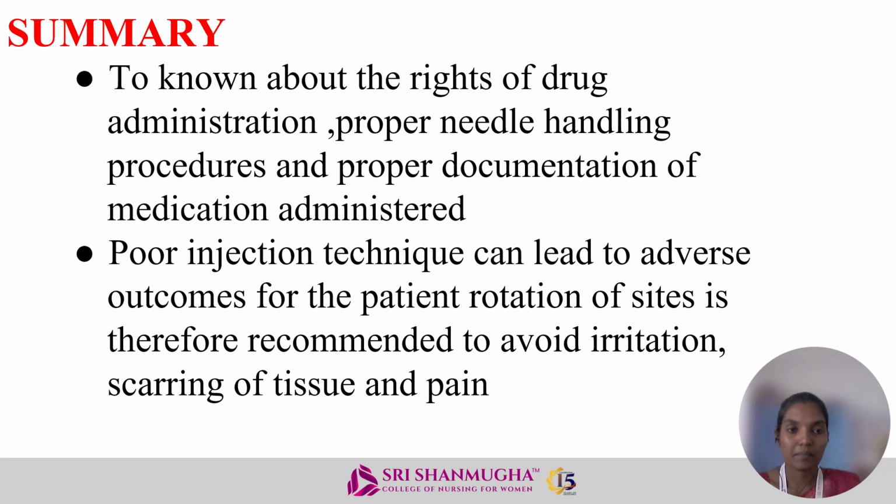Next one, summary. To know about the rights of drug administration, proper needle handling procedures and proper documentation of medication administration. Poor injection technique can lead to adverse outcomes for the patient. Rotation of sites is therefore recommended to avoid irritation, scarring of tissue and pain.